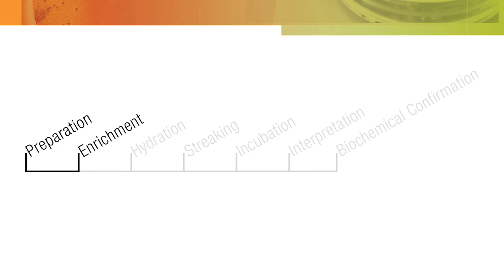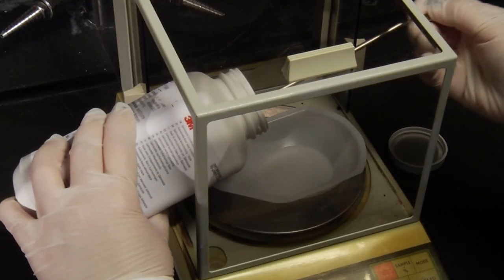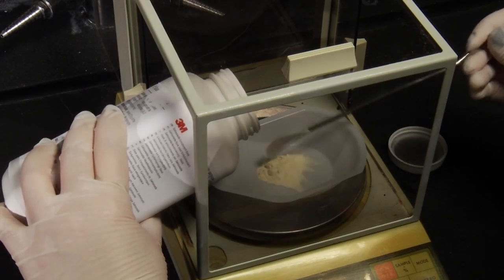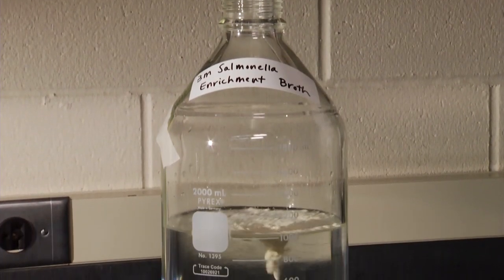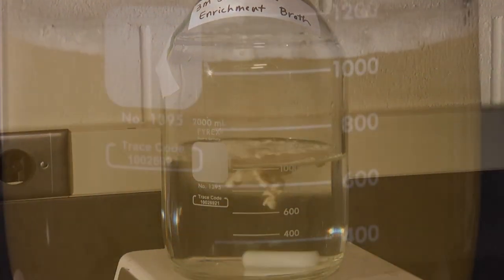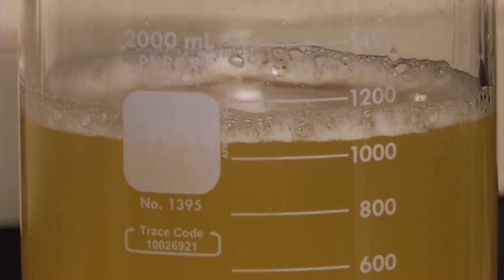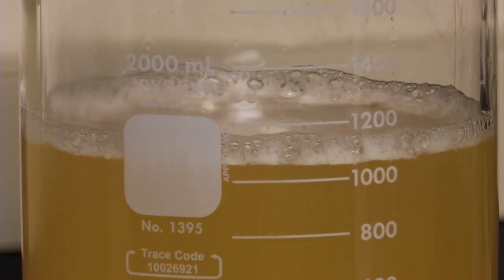The next step is the enrichment procedure. In order to prepare 1 liter of 3M Salmonella enrichment base, weigh 37 grams of dehydrated base powder and add it to 1 liter of water. Follow the product instructions to mix, dissolve, and sterilize the media.